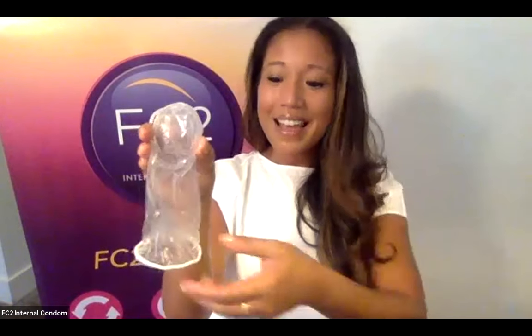Now you can go ahead and open your package here at the arrow, and when you take the FC2 internal condom out of the package, you'll see that it looks like this. There's a closed end with a very flexible inner ring and an open end with a wide outer ring. That inner ring is used to insert the condom into the body and it also helps to keep the condom in its proper place during sexual activity. The outer ring should always stay on the outside of the body, covering the area around the vaginal opening.